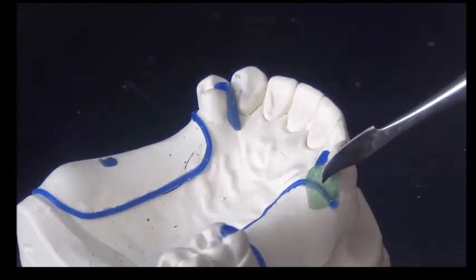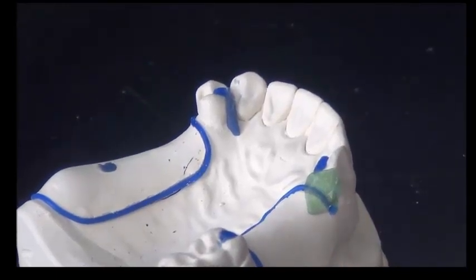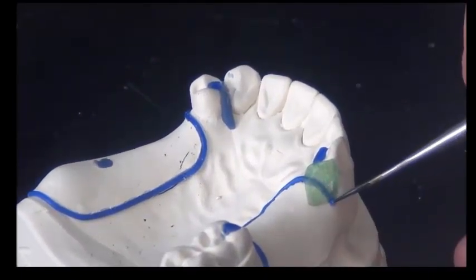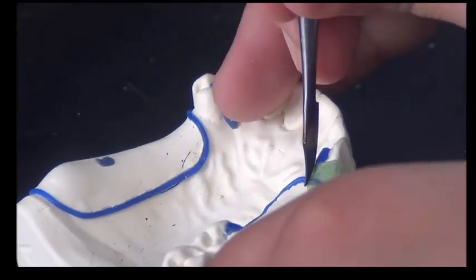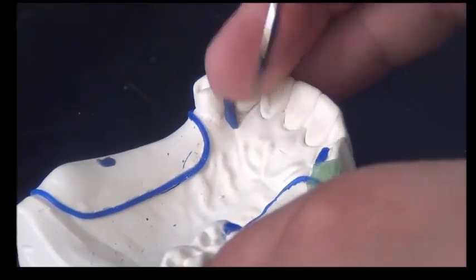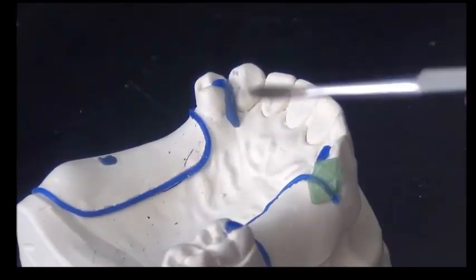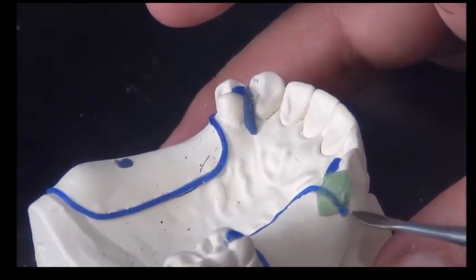We adapted it to the canine because the canine is a triangle in cross section. We adapted it in an oblique manner. So we fit the tip here and we cut off the excess, and we're going to cut any excess from the palatal. And with the back of my round instrument, I can just press on the wax to make sure that the corner is adapted very well.